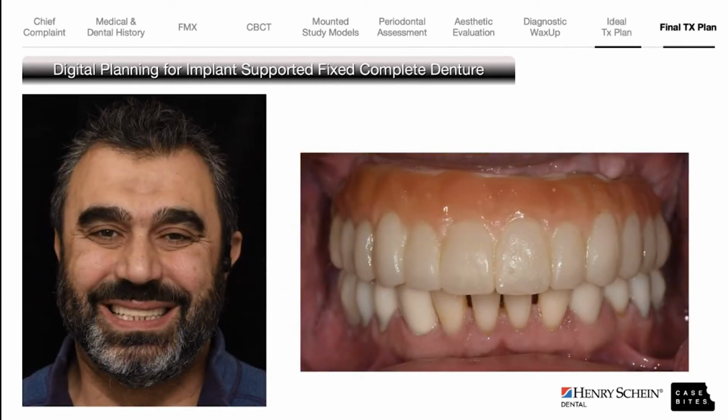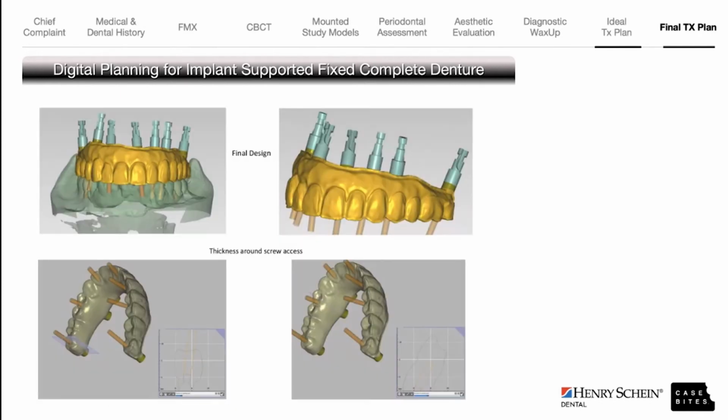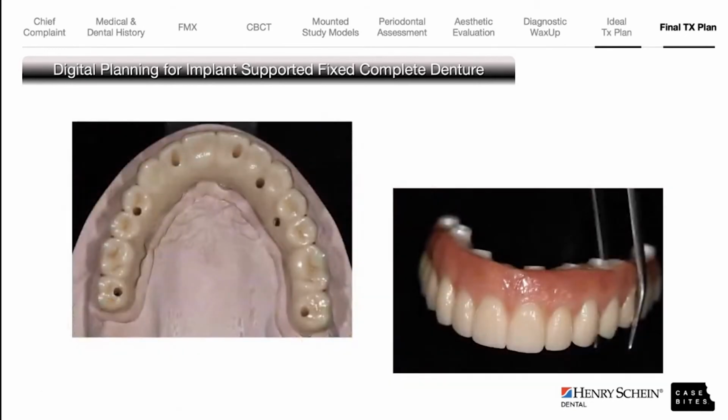Now that the patient has healed, we made some modifications to the provisionals. Dr. Abdallah provisionalized the lowers as well. And at that point, we are ready to go. We basically scanned that provisional, full contour, and did some digital cutback. If we decide we don't have to necessarily do a cutback for the teeth, we can just do a cutback or staining of the pink area. And then the frame is milled, veneered in this case, and delivered.